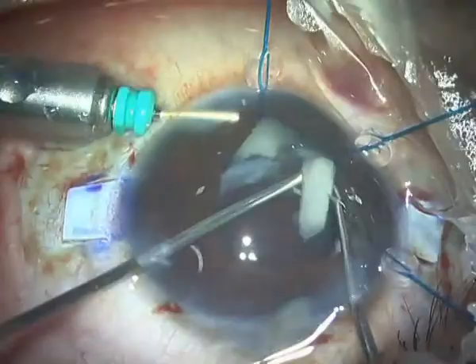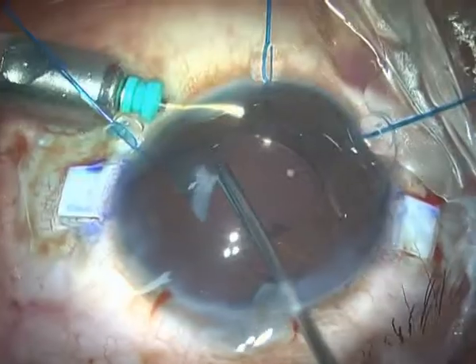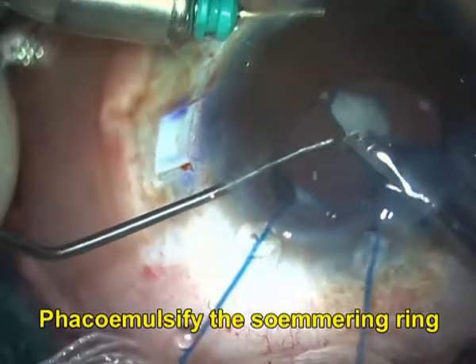Placing some iris hooks, I'm able to quadrant by quadrant express the Soemmering ring outside the eye. The last piece was a bit too large and needed a phacoemulsification technique — an IOL scaffold, or a glued IOL scaffold in this case.